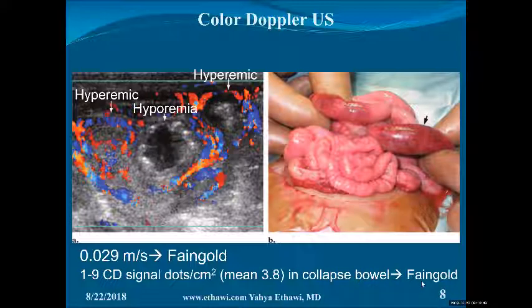And again, this is a study, okay? Remember to control the window, the gate of the pulse Doppler ultrasound, because this is used only with pulse Doppler. That's when he concentrates on one view. And you can see this bowel here. There is no signal, so this bowel is almost dead. Also, you can see in this bowel there is pneumatosis intestinalis.